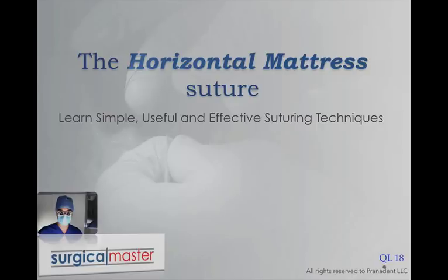This is part of a larger training and coaching program on suturing that I created especially for doctors that are feeling frustrated and having some problems with their suturing techniques. I'm going to show you very simple, very useful suturing methods that can make your surgeries work out better and you can also enjoy the process and be less frustrated.